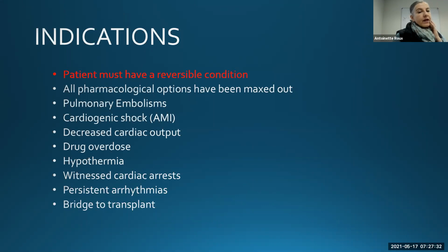If you have a patient on VV ECMO and you're not heating him up or keeping his temperature between 36 and 37, he is definitely going to get a bradycardia due to the external part of our circulation, because most of his blood is circulated outside and cools down tremendously fast. So we need to heat the patients up and protect their temperatures.